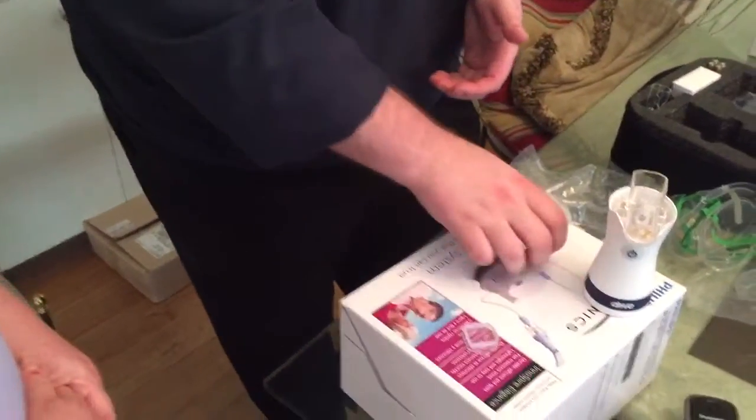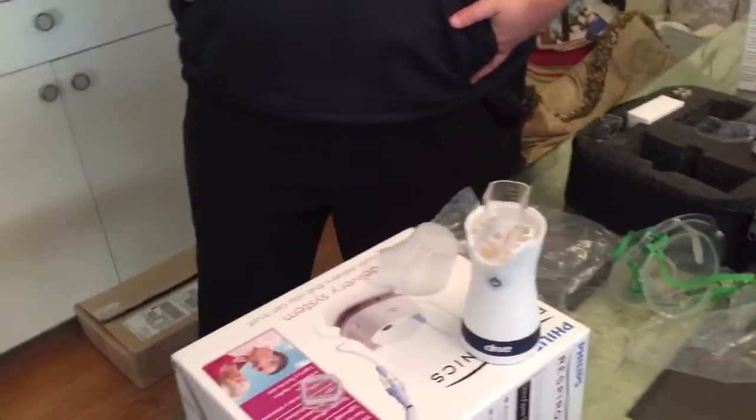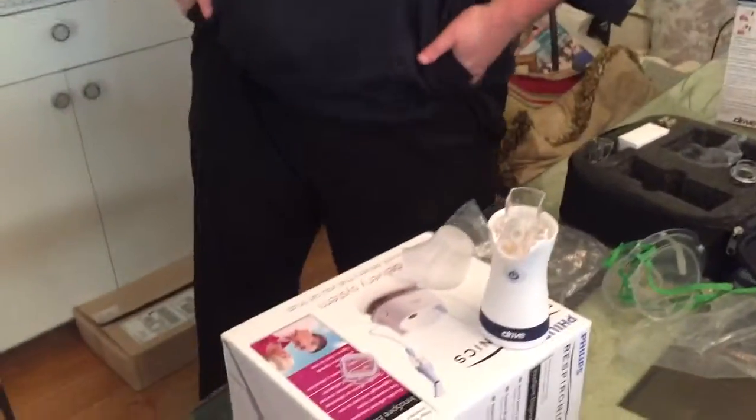I can give you a quick description of it: it's rectangular, about yay big — palm of your hand pretty much. You hook it up just like this one; it uses the same kind of nebulizer kits. You clean it the same way — rinse with warm soapy water and let it air dry. There's really no difference from this one. But again, this is the first time I've worked with it, so I can't give an opinion.